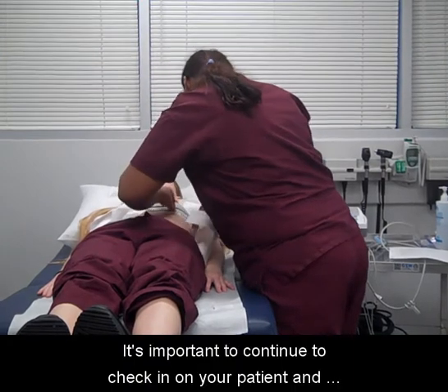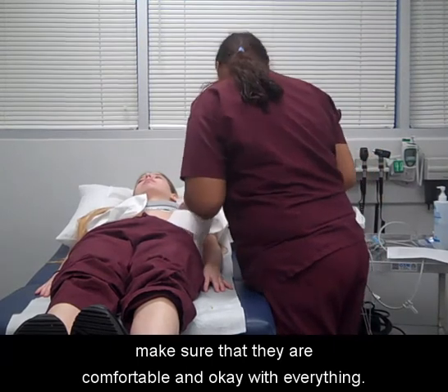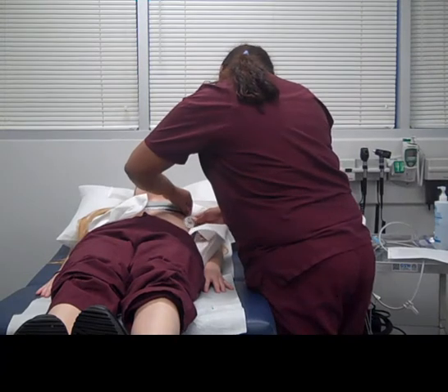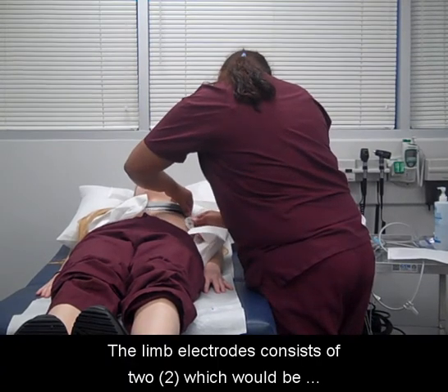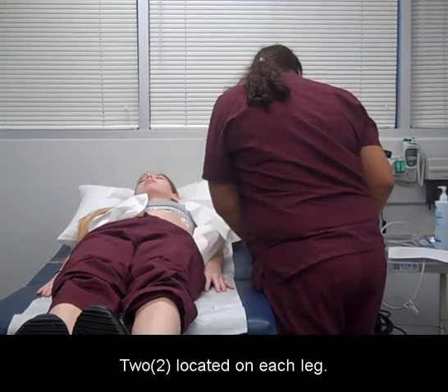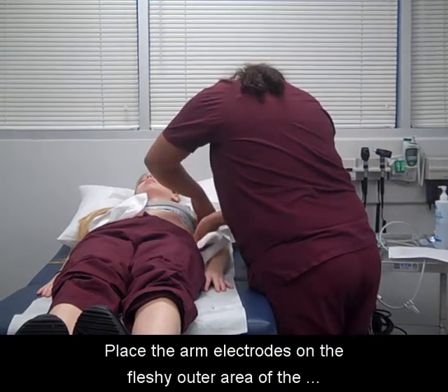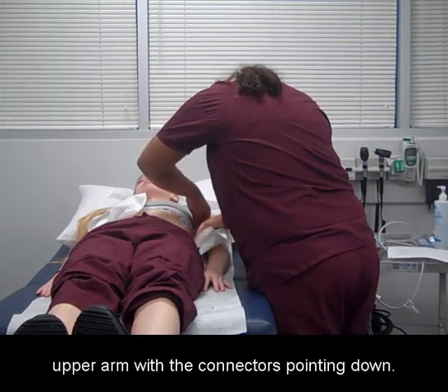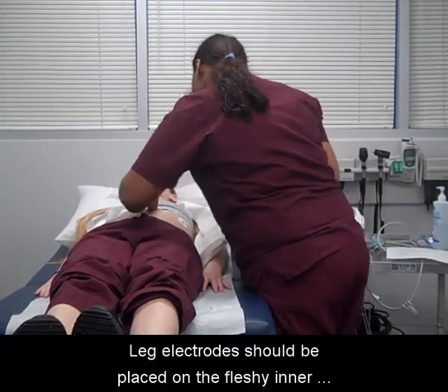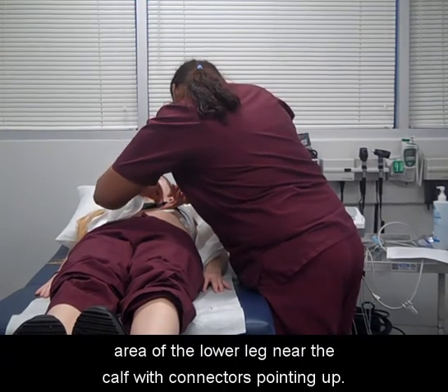It's important to continue to check in on your patient and make sure that they are comfortable and okay with everything. Remind your patient not to move. The limb electrodes consist of two, which would be located on each arm, and two located on each leg. Place the arm electrodes on the fleshy outer area of the upper arm, with the connectors pointing down. Leg electrodes should be placed on the fleshy inner area of the lower leg near the calf, with connectors pointing up.